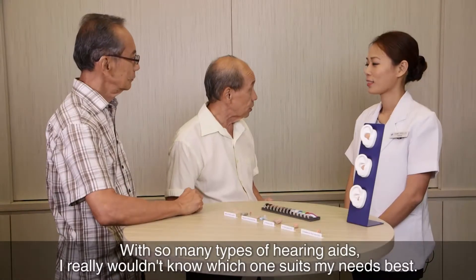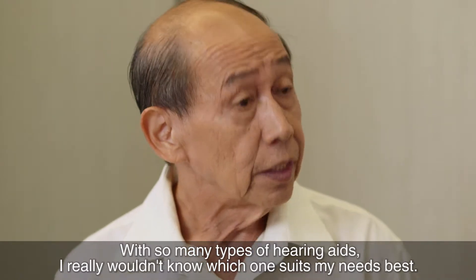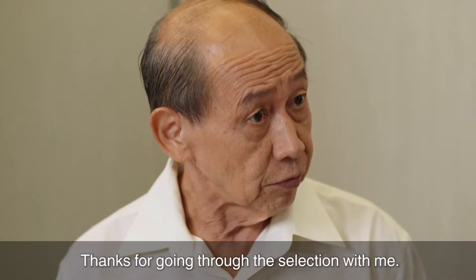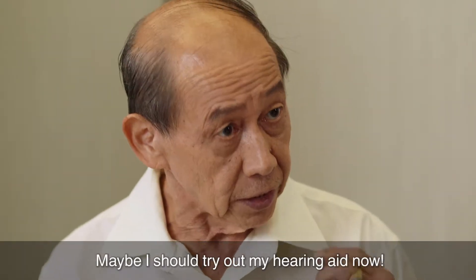With so many types of hearing aids, I really wouldn't know which one suits my needs best. Thanks for going through this lecture with me. You are most welcome. Maybe I should try out my hearing aid now.